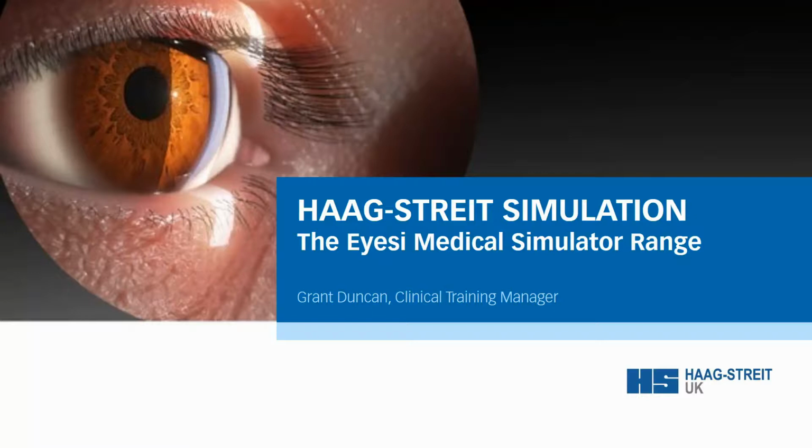Today I'd like to present to you on the Eyesi Medical Simulator range. My presentation will cover the following topics. We'll start with a short video describing each of the medical simulators in the ophthalmic range: the Eyesi Surgical, the Eyesi Direct and Indirect ophthalmoscopes, and the newest member of the Eyesi family, the Slit Lamp simulator.